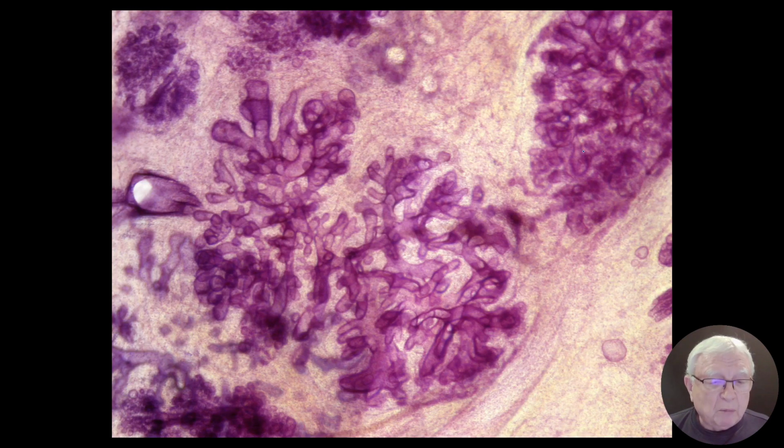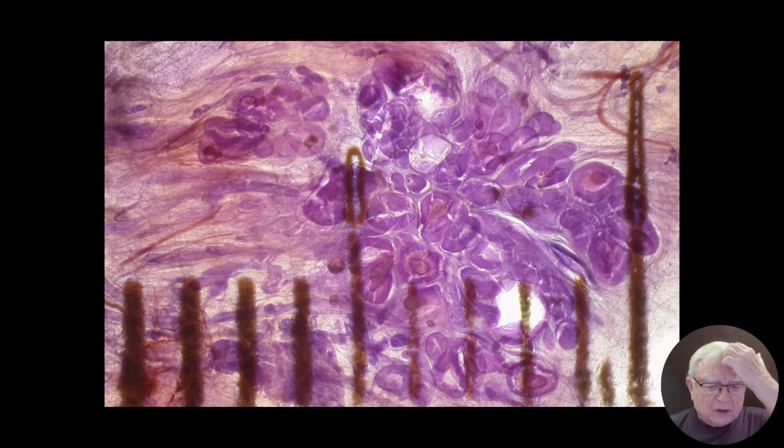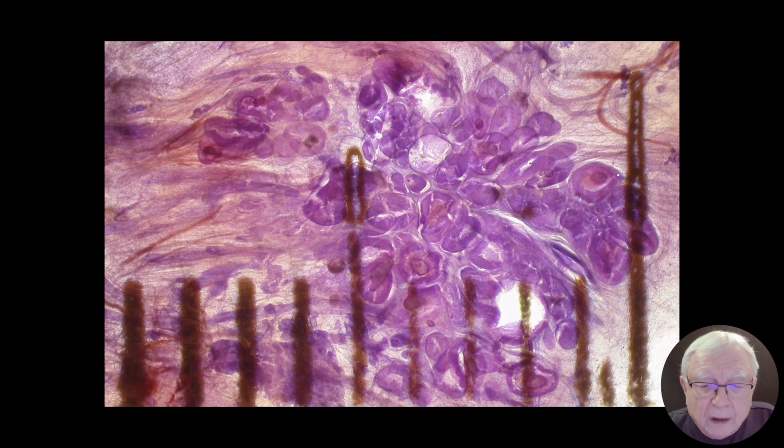You know this. Blunt duct adenosis. Fantastic. Here is a thumb and here is a thumb. Now tell me what this is. The size is 7 millimeter. The acini are distended.